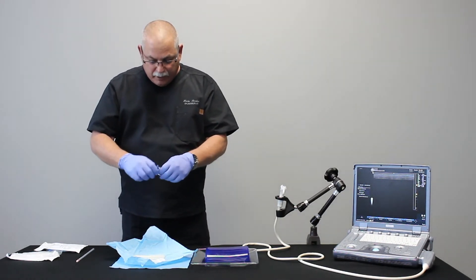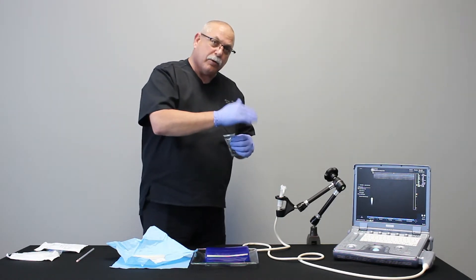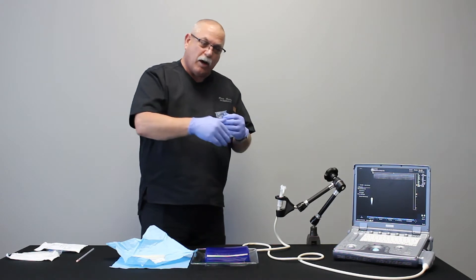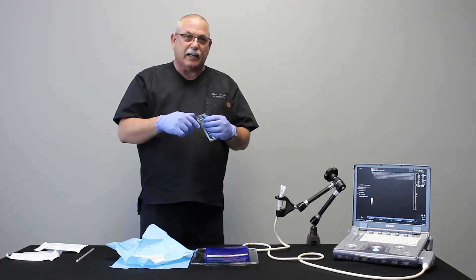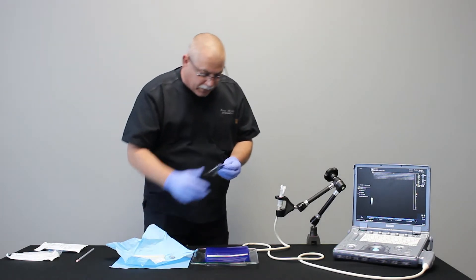The first thing I'm going to do is put a little bit of gel onto the probe. You can put gel onto the probe before you put the cover on, or you can put the gel inside the cover — it's a personal preference. Personally I like to put it on the probe itself.